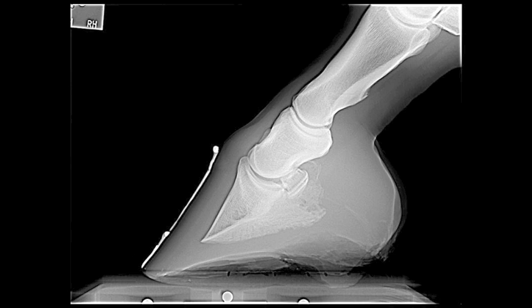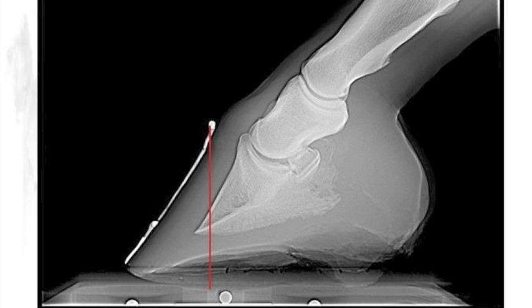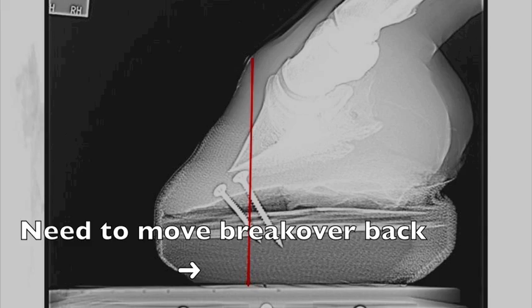Here's an x-ray of that same foot. We put a radio-opaque marker on the front of the hoof wall extending from the coronary band down to the tip of the toe. That gives us an outer landmark we can use for lining up the clog to know exactly where we want the breakover to be. We drop a line from the top of the coronary band down to the sole, which gives us an approximation of where our breakover should be. If the breakover is too far forward after placing the shoe, we can then adjust it.